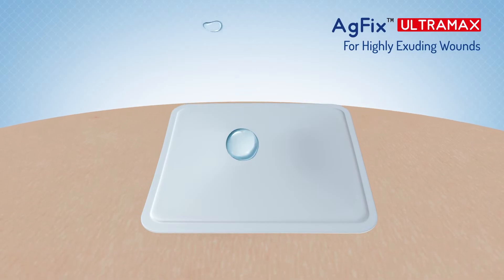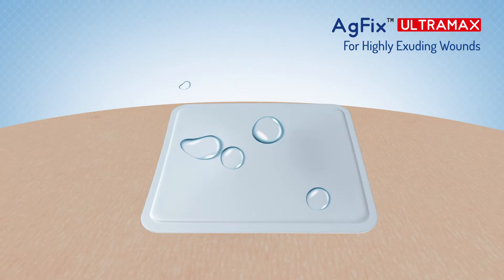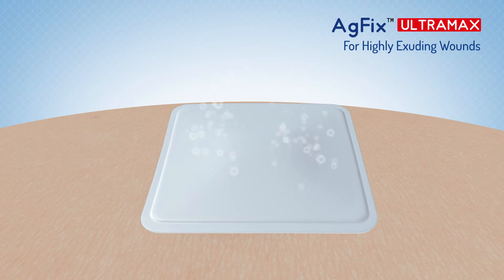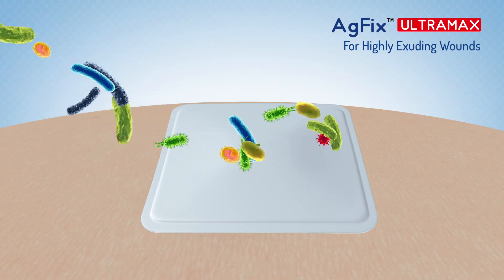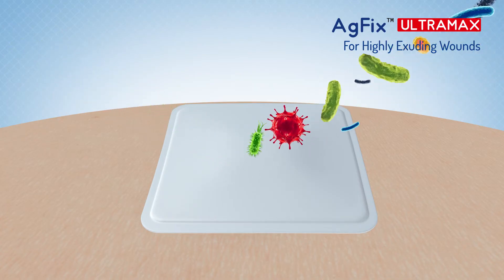AG Fix Ultra Max has a PU film backing which is waterproof, breathable, and prevents exudate strike through to the outer surface of the dressing. It creates a sterile barrier to external contaminants including liquids, bacteria and viruses.